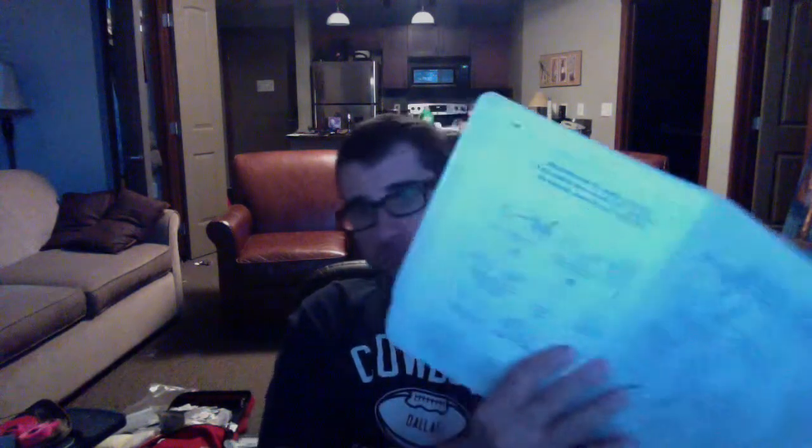But if you download the book of midwife, there's a page that explains what you should pretty much have. It comes down to 4x4s and towels and things like this. You can always have towels and things on the go instead of a kit like this, but I find it more convenient to have the kit, and it fits well in that pocket.